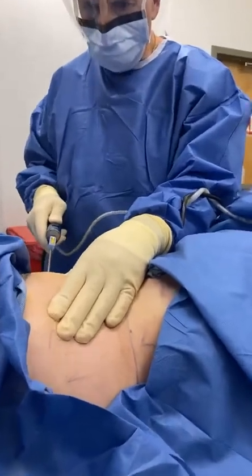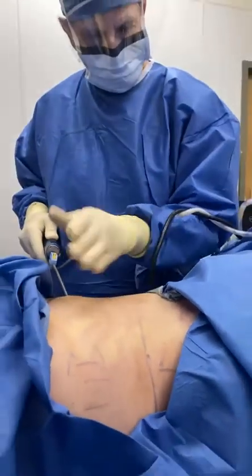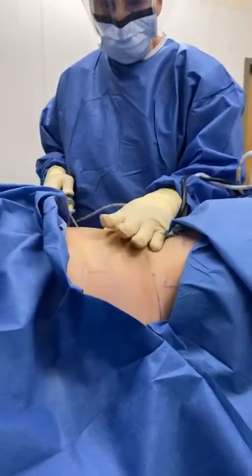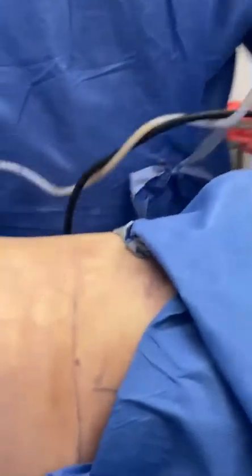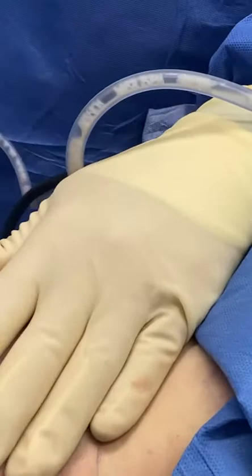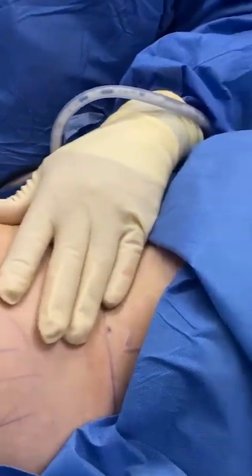Emily, we've done one side already and we've turned her to the other side. Notice the difference — she doesn't have that curvature anymore. She doesn't have much of a problem either, but look at this yellow aspirate. Look how nicely we do these here at the Cosmetic Surgery Center of Posterito in a very controlled manner — very nice and gentle.